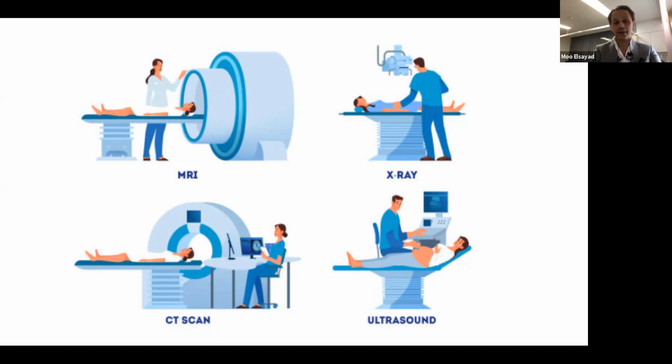It is very deep, as you see there. When the patient goes in, it engulfs the patient inside. So some patients are claustrophobic and they really can't tolerate the examination, but it's a very useful tool because it helps us to identify complex soft tissues, complex pathology within the small bowel, large bowel, and the brain.